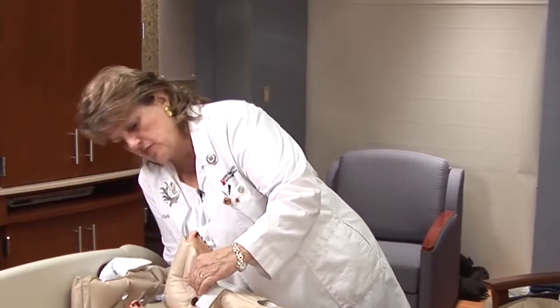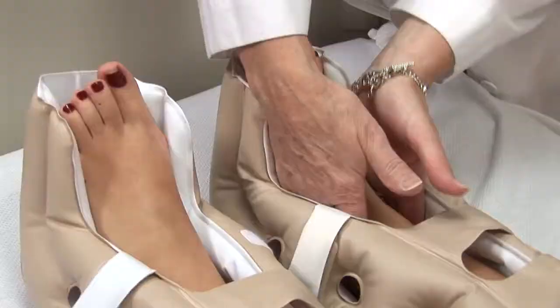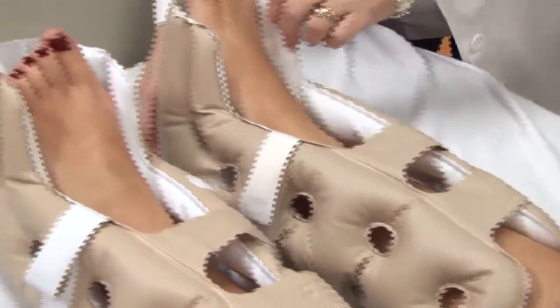I'm going to check on the bottom to make sure that your heel is actually floating. Every shift, the nurses are going to check to make sure that the boots are fitting you adequately. They will put their hands inside, underneath the straps to make sure they're not rubbing, and they're going to feel underneath to see if your heel is truly still floating.